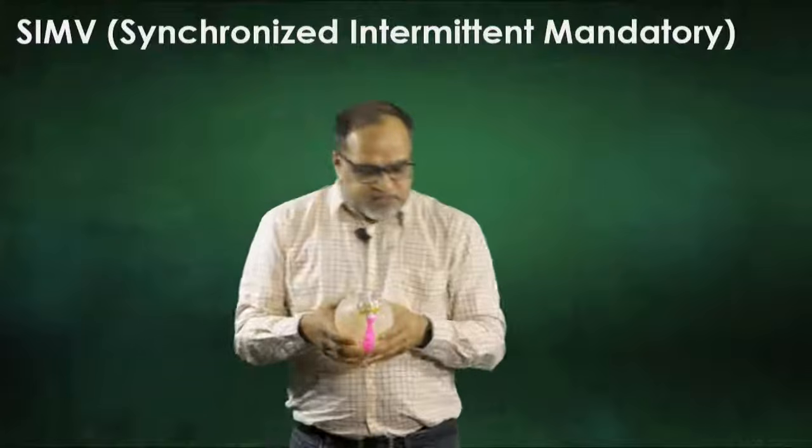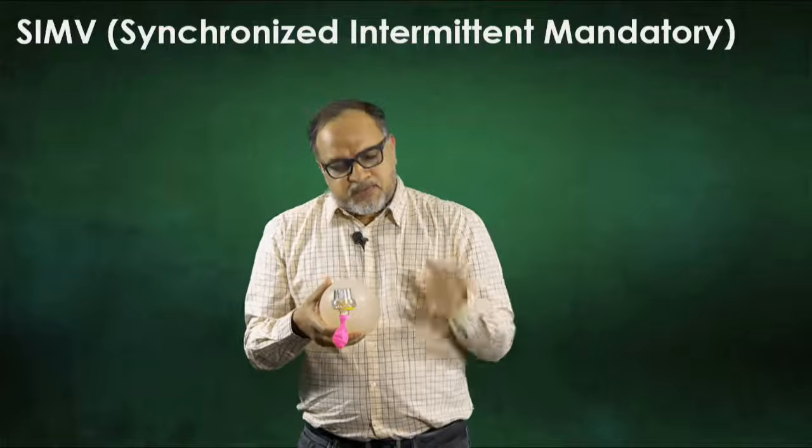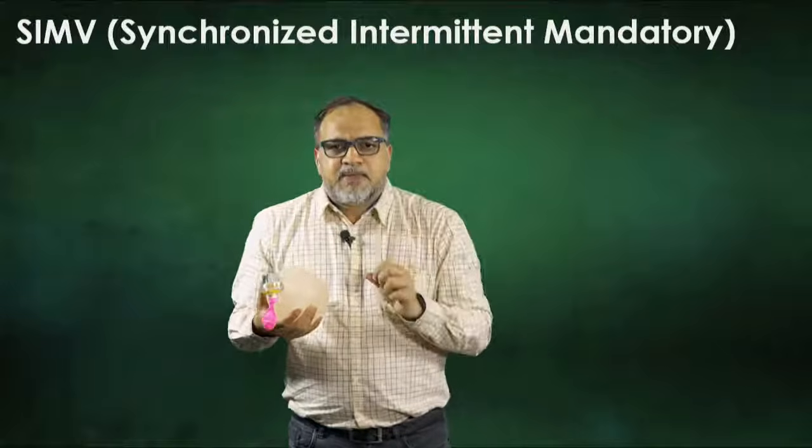Now, same way, this SIMV, again, 1, 2, 3, in between the patient tried to breathe, the ventilator ignored it, 4, 5, 5.5, and the ventilator gave the mandatory breath as a supported breath. So this was synchronized intermittent mandatory ventilation. It had one problem, that the breaths that were coming between the mandatory breaths were not respected, and the patient felt dyspneic.